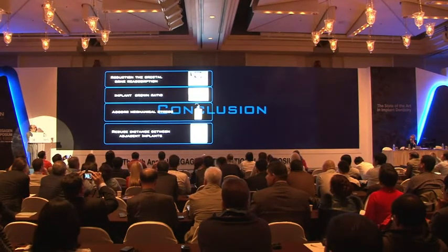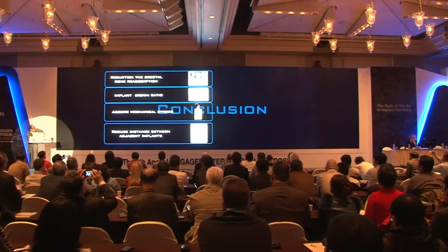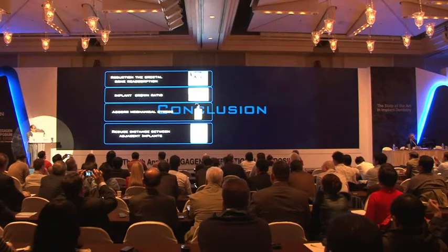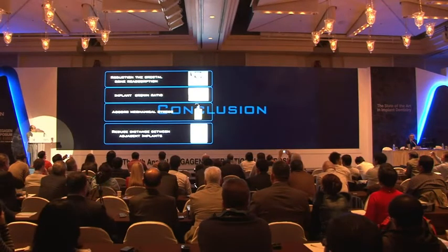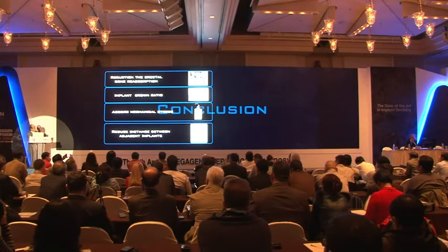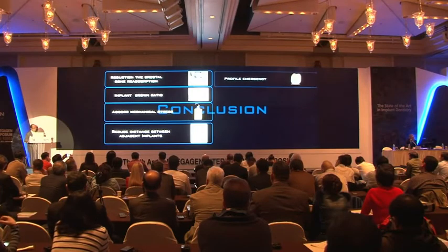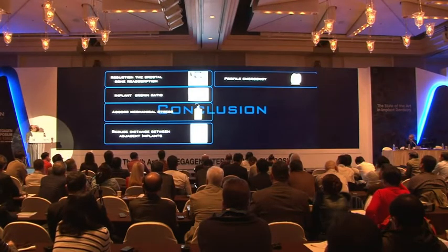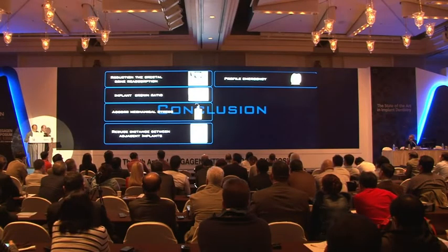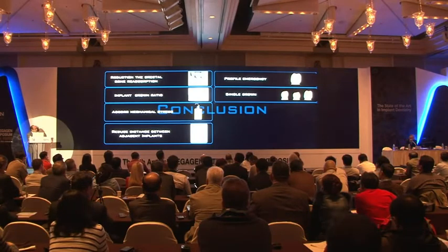We can use more implants for a big crown. And this is very important for us in the molar zone, where we can use a diameter of 3.5 for a big crown, because we have a very strong connection. We can use the emergence profile that we like, because we are far from the connection, because we insert the implant under the bone. We have a strong connection, so we can use a single crown.